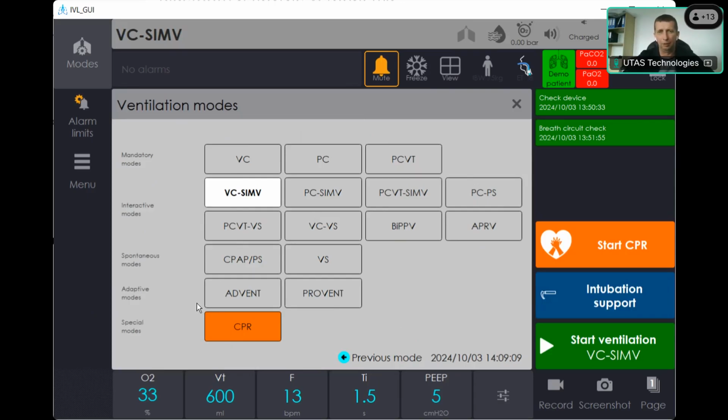Yeah, like for example, they score a patient, and then is there any function available where they can automate the ventilator, or do they have to manually adjust the settings according to the patient condition? These modes basically take into account only the breathing mechanics of the patient and spontaneous activity of the patient, but never the state of his consciousness. This is a very important thing.